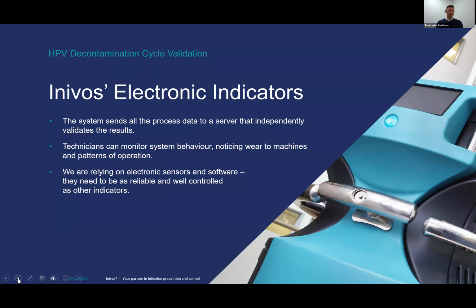Thanks. No, I think it's really important to say that we've been developing decontamination cycles for quite a while now. And one way we saw for us to improve is to understand exactly what happens throughout the decontamination cycle in order to see which parameters need to vary or change in order to get the right level of efficacy, at the same time reducing the process time and reducing the concentration of our starting solution for hydrogen peroxide.